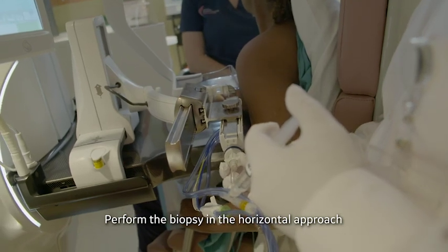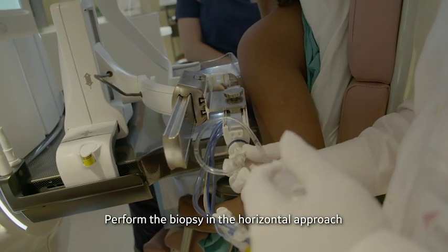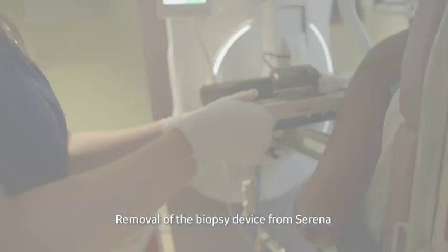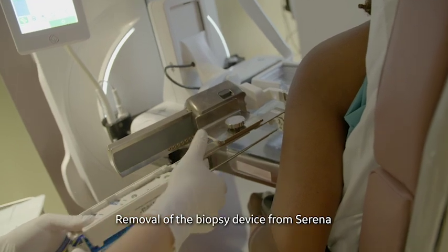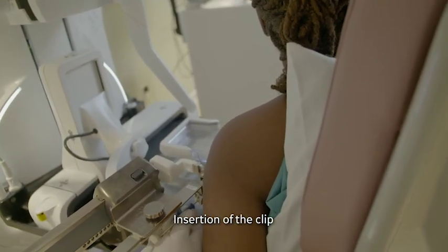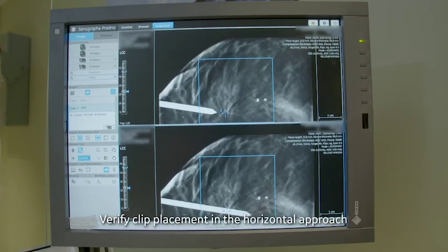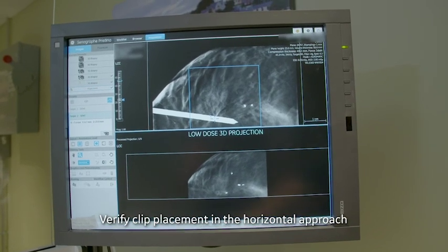The biopsy is then performed. The needle is removed and the clip is inserted. Dr. Schroeder inserts and deploys the clip, and a final 3D acquisition is performed. This final image is used by the radiologist to verify the clip is at target.